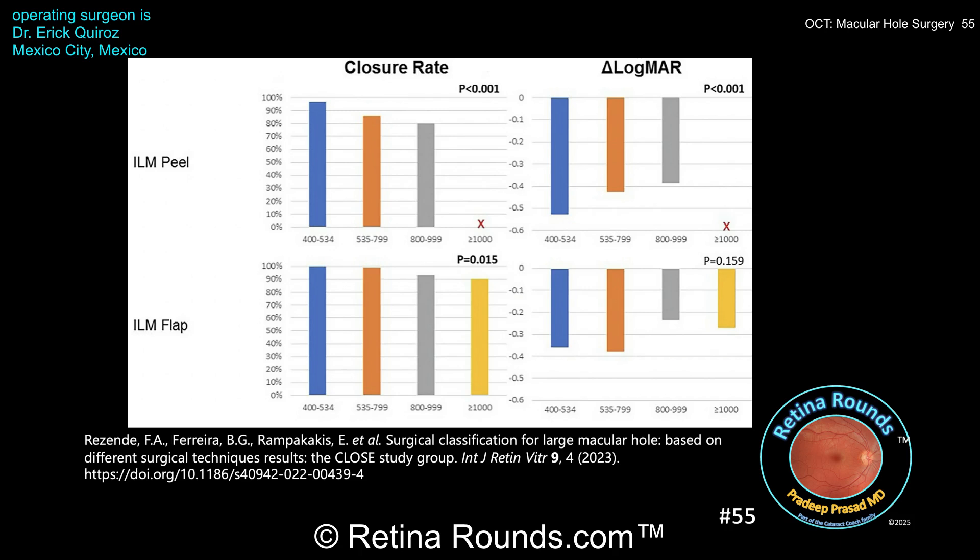Going back to the size of the macular hole: small and medium-sized holes have a higher closure rate, and ILM peeling can increase the likelihood of closure. For large or extra-large holes like this one, this table from the CLOSE study group publication in 2023 shows that both ILM peeling and ILM flaps have a high rate of closure and vision improvement — although ILM flaps have a higher closure rate, ILM peeling appears associated with better visual outcomes. For this case it would be reasonable to proceed with either technique.